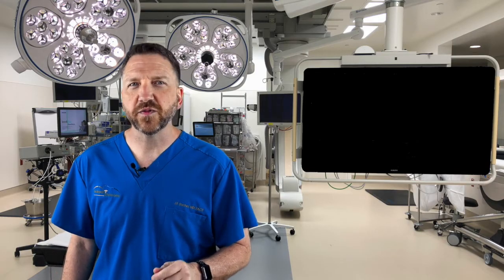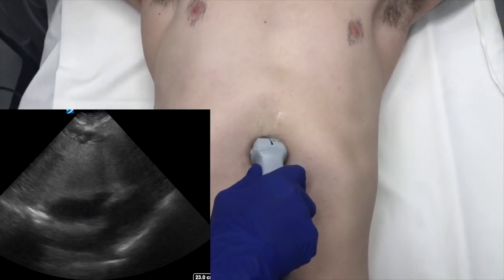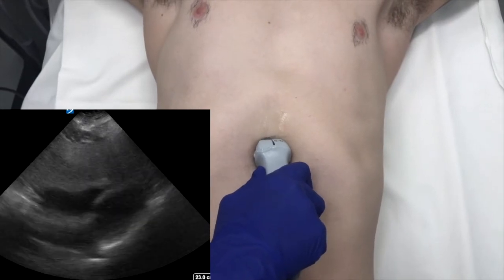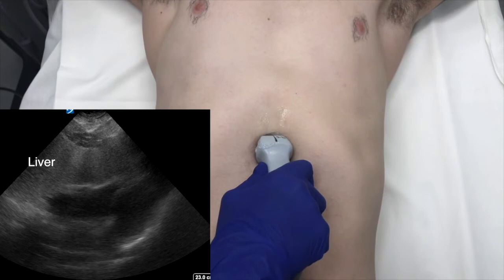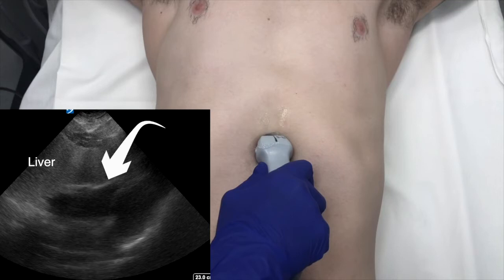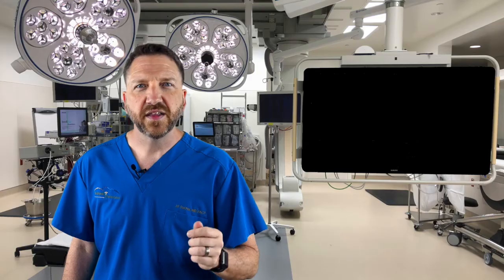The pericardial space can be viewed from two different positions depending on the patient's particular anatomy. The sub-xiphoid window is obtained with the probe just below the level of the xiphoid oriented in a horizontal position aimed superior and slightly left towards the heart. The left lobe of the liver is seen in this view along with the right side of the heart. The border of the heart should be seen against the bright stripe of the pericardium. In obese patients, there may be pericardial fat seen anteriorly between the heart and the pericardium, which can be easily mistaken for fluid. However, blood should pool dependently and therefore should be visible completely around the heart, not just the anterior aspect.